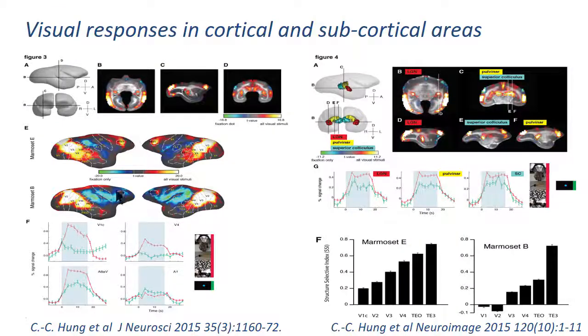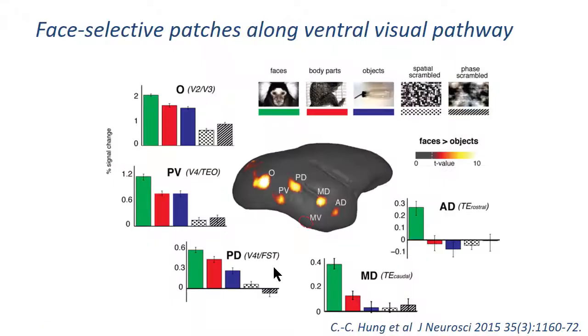And the data that we acquire with this kind of experiment is really outstanding. We can see activation of primary, secondary, tertiary, and higher order visual cortices, with lots of properties that I don't have the time to get into here, but data that really has very strong homology to data being acquired in macaques and the human brain.